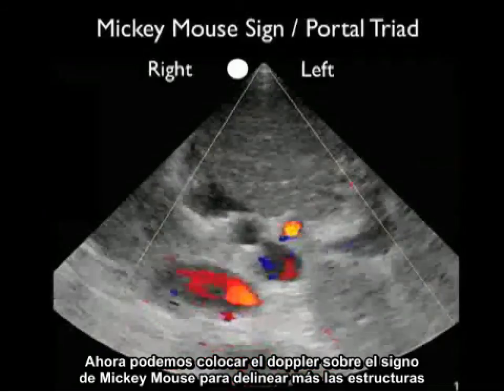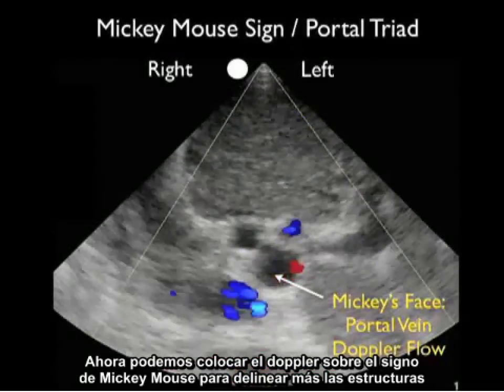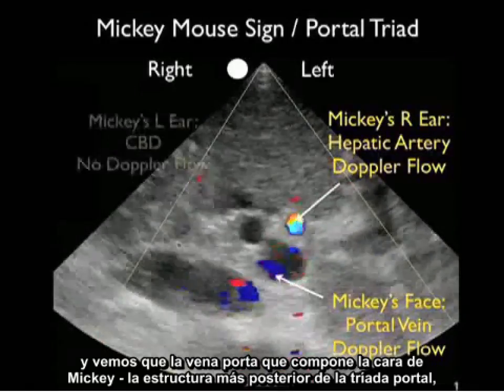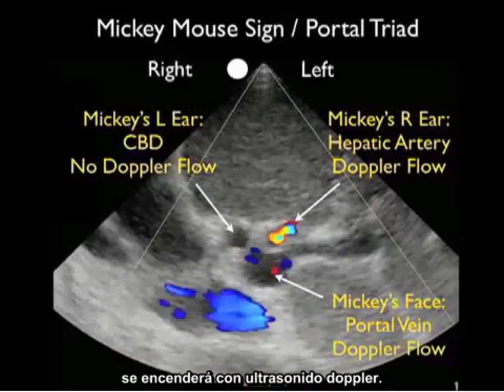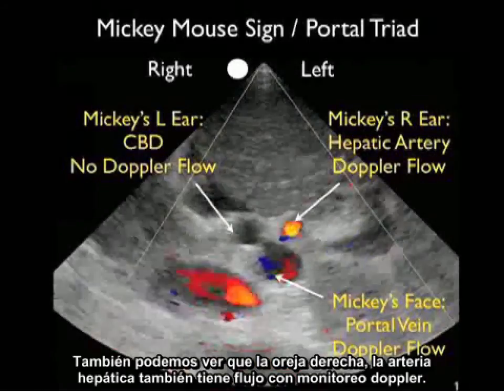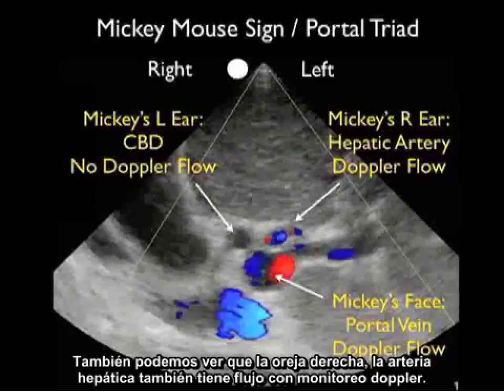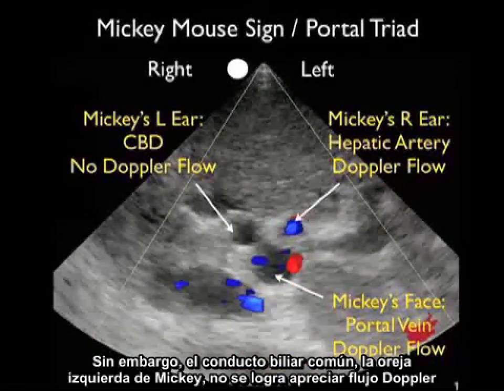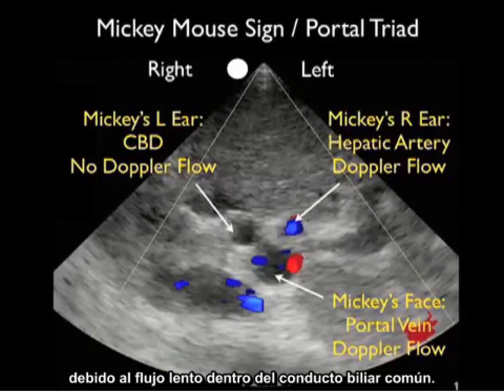We can place Doppler sonography on the Mickey Mouse sign to further delineate the structures. The portal vein — Mickey's face, the posterior-most structure — lights up with Doppler. Mickey's right ear, the hepatic artery, also shows Doppler flow. However, the common bile duct — Mickey's left ear — fails to show any Doppler flow due to the sluggish flow within it.